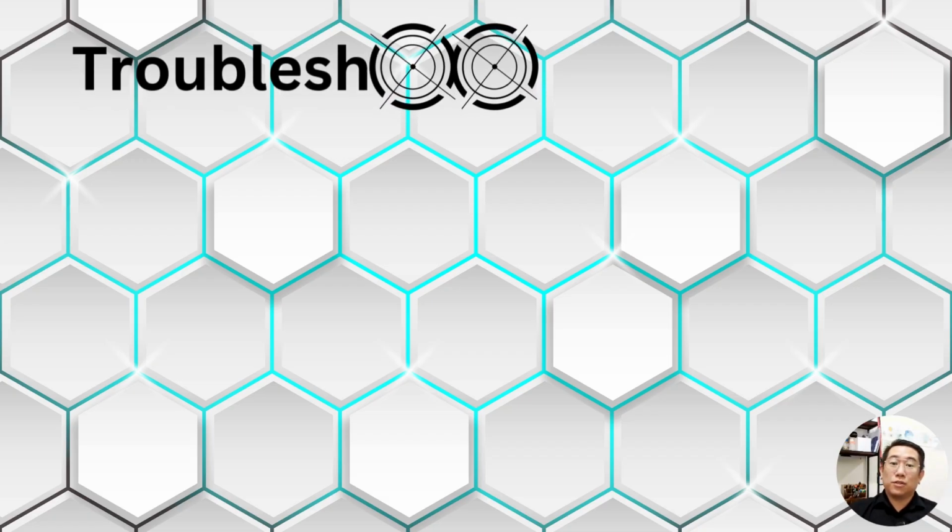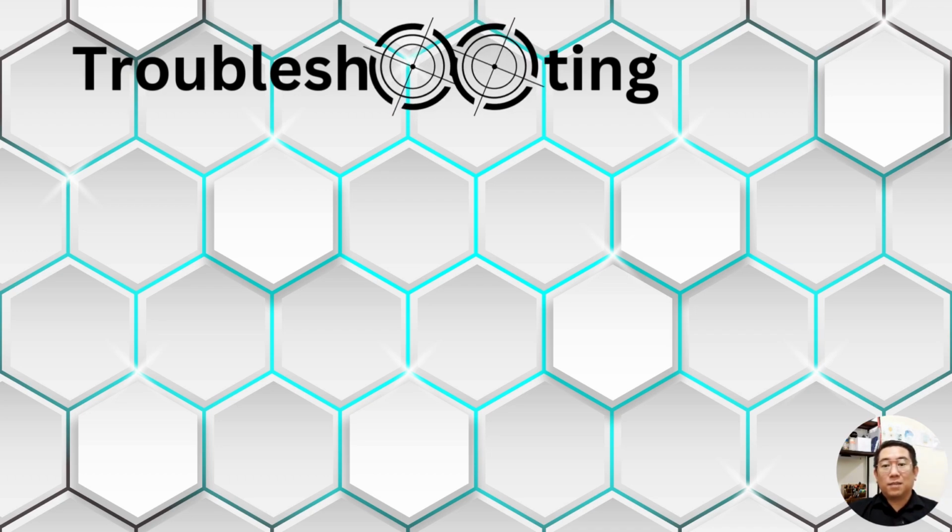Now let's move on to the troubleshooting of the Humphrey Field Analyzer. Sometimes problems occur during a visual field test. One common issue is excessive fixation losses, which usually means the patient is not looking at the central target. In this case, we should calmly re-instruct the patient and repeat the test.